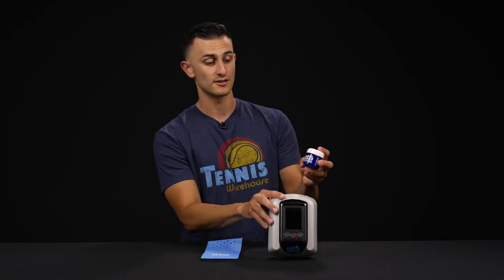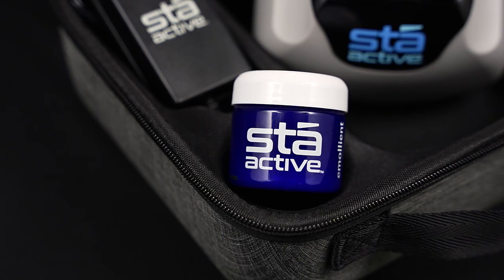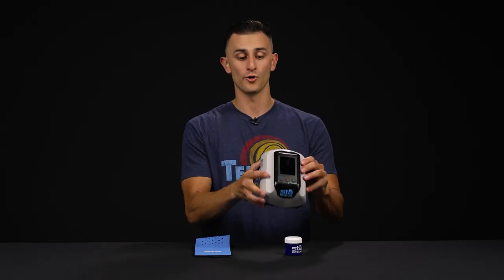This emollient that I have behind the device here — a little bit of this goes a long way. It's just meant to lubricate your arm, keep your arm hairs where they need to be. And now I can show you just how the device works.